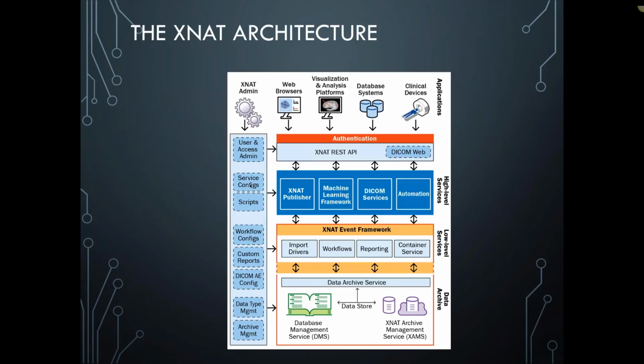So this is the XNAT architecture in some detail for those who like the technical view of things. Importantly, it does have a full DICOM suite of services, so it does know how to communicate with DICOM workflows from the clinical side. So you can push images directly from modalities. You can query out to the PACS, and you can submit data from XNAT back into PACSes. And that's really useful on the clinical side of things and integrating with the scanners themselves.